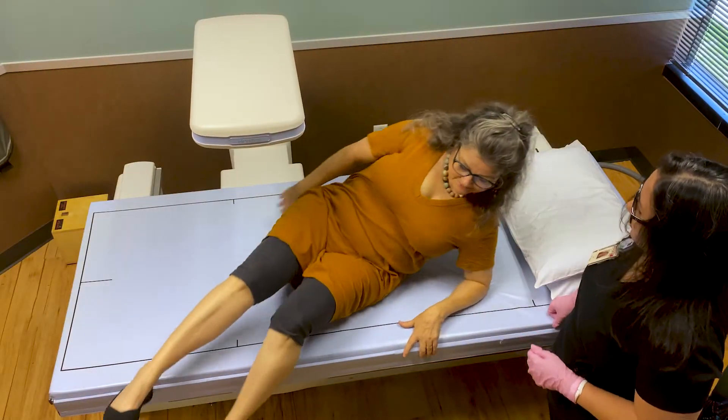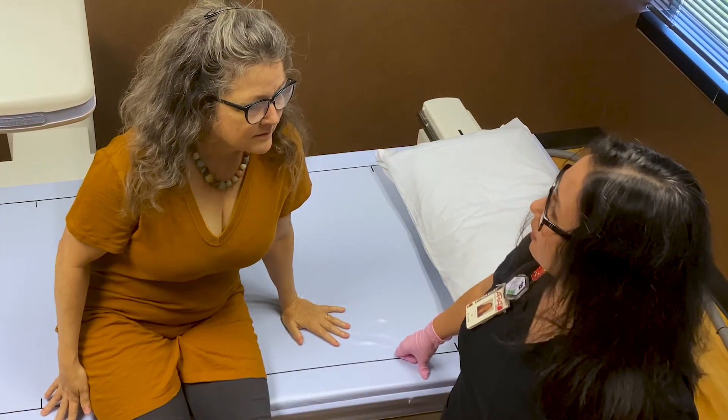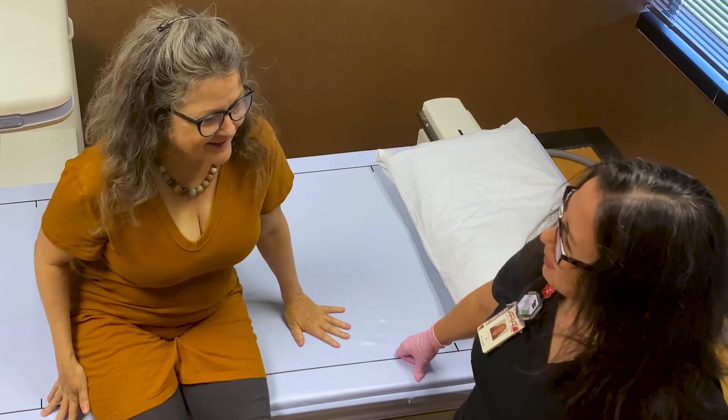We'll give these results over to your doctor and you'll also receive a letter in the mail with the results. Thanks, Erica! So that was about five minutes and it was super easy and completely painless. I'll see you again when we talk to Dr. Tharp about my results.